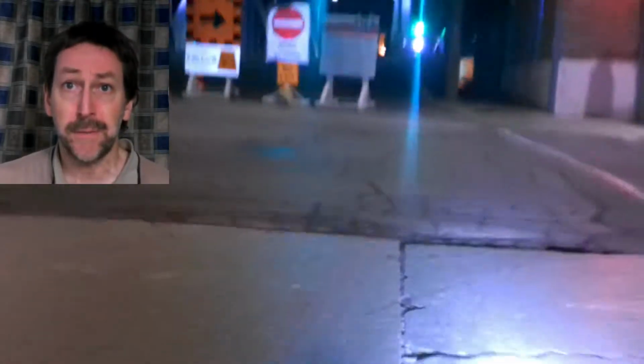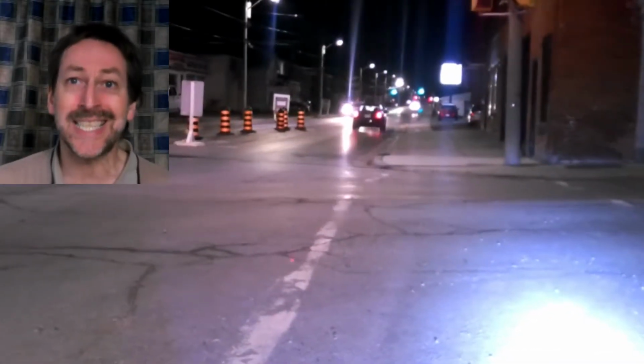Now, in terms of practical help, this light actually makes the street signs fluoresce. Stop signs reflect the light back. So it helps in the short term, but I can also see at a distance with this light.